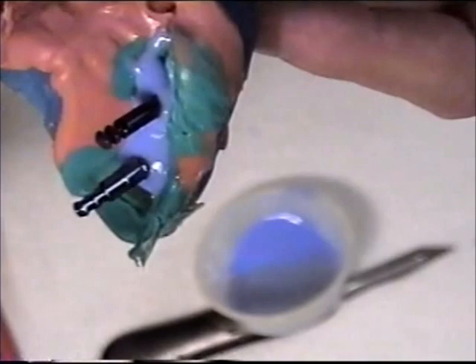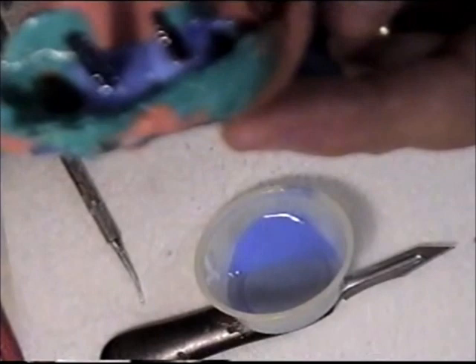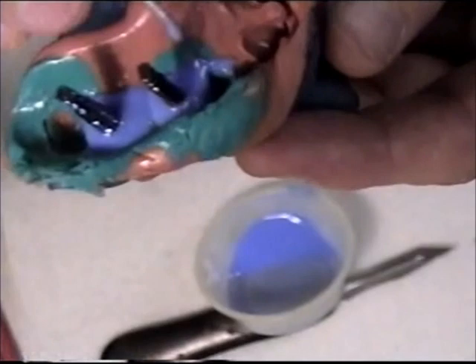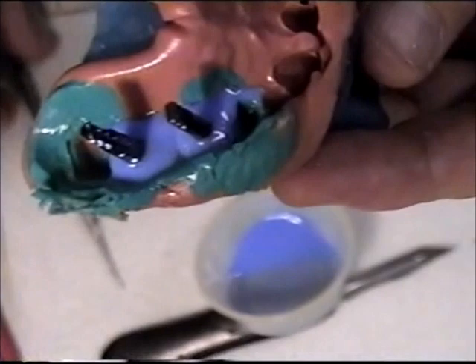It'll take about 15 minutes before it gets fairly rigid, so we can use a surgical blade to cut it away. We're going to make some cuts here and here, here and here. We're going to remove any excess off the impression. And then we're just going to pour it up like a regular model.